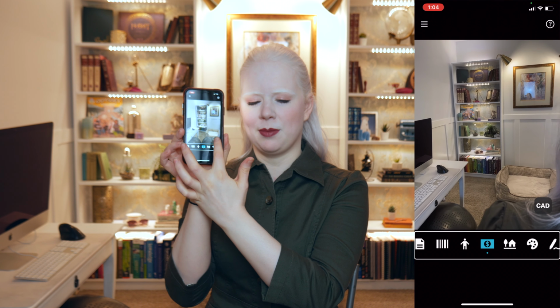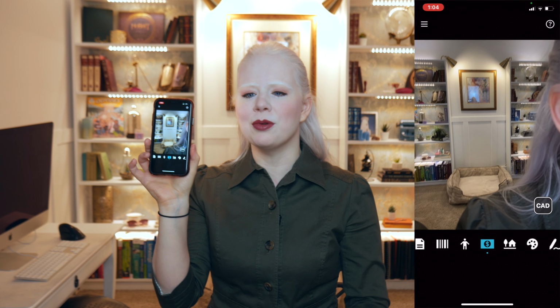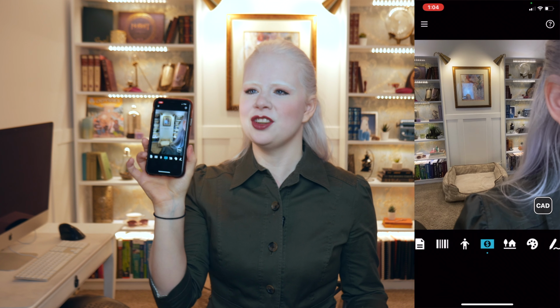Right now, if I swipe left, Recognizing Canadian dollars. it's set to Canadian dollars because I am Canadian, but it works with just about every known currency. It's really fantastic if you're going to travel to a different country and you're not familiar with the currency or what it is. So I'm going to grab some Canadian dollars and show you how that works.